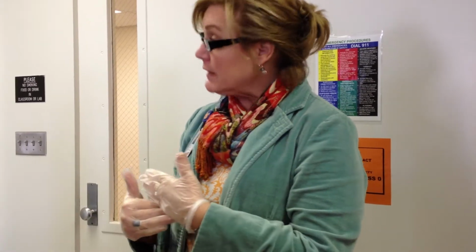today. Okay? Now, in order to begin, first I need to verify everything, all the 7 rights or 8 rights. How many are there now? 8. You need to go through all of those things, look at your MAR, know about your medicine, verify everything that you need to verify. As we're drawing it up, go through those steps.